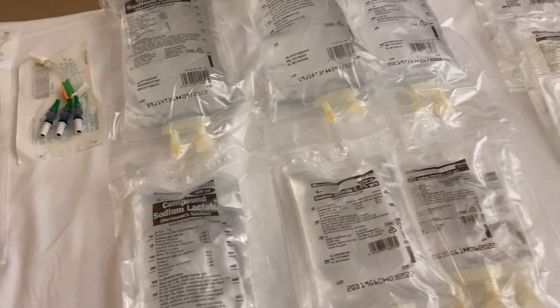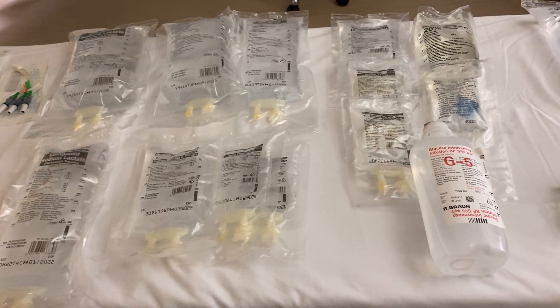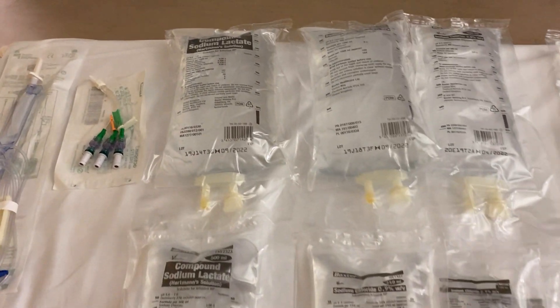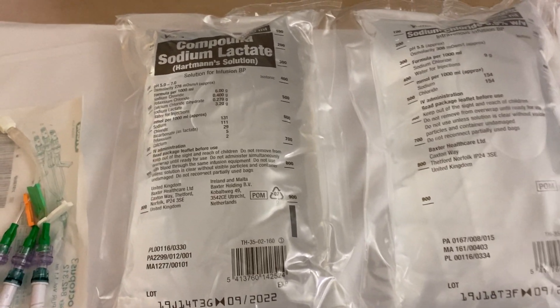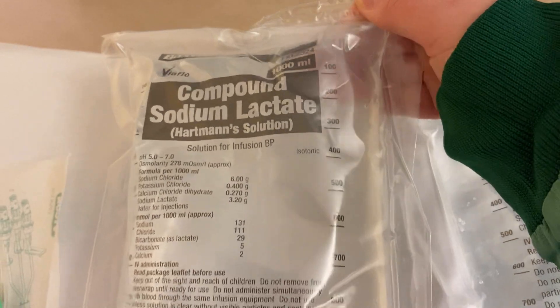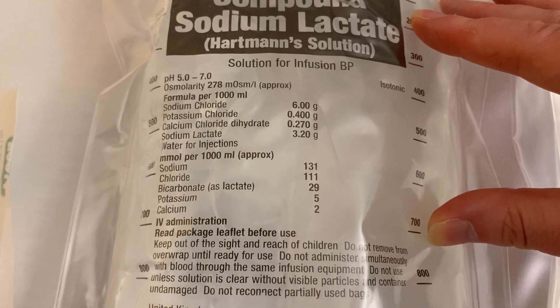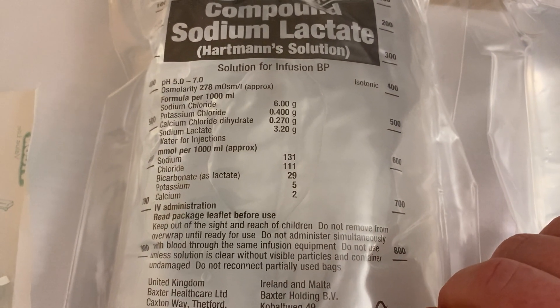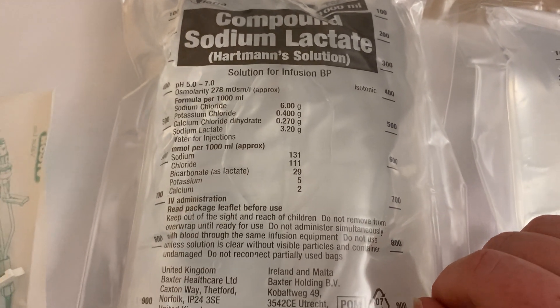Moving on to IV fluids — these can be largely divided into crystalloids and colloids. We'll cover crystalloids first and then gelofusion, the one real colloid I have here. First is compound sodium lactate, or Hartmann's solution as it's commonly called. Common to all these bags is they display their name, volume, pH, osmolarity, and contents in grams and millimoles per litre — everything you need to know about what you're giving. I'll go into more detail in a PowerPoint presentation.